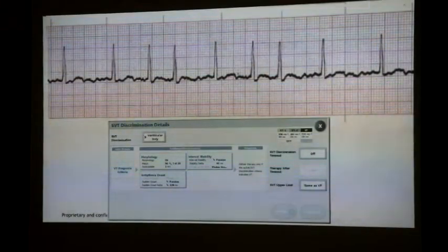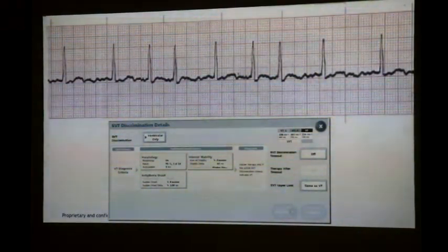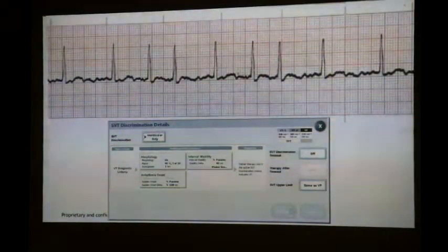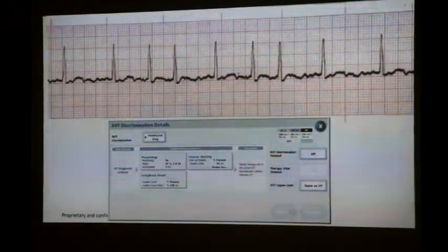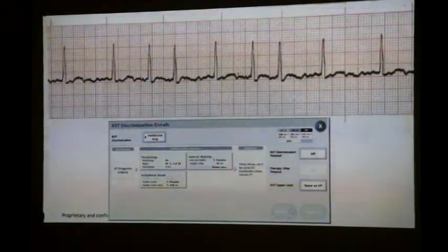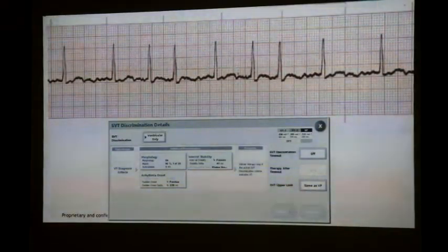So when you program them at 180... Oh, but if it's a single chamber ICD, yeah, but for primary prevention, probably not. But if they have right bundle branch block, then they have some kind of conduction system disease. So the likelihood of conducting up at 190 beats per minute, the rate is low. Yeah, and that's why we keep rates up. That's another reason to keep rates up. Those kind of difficult rhythms that are hard for the computer to work out aren't even looked at.